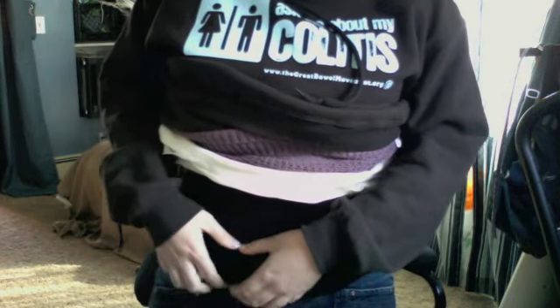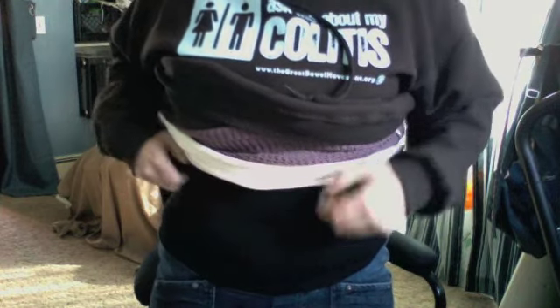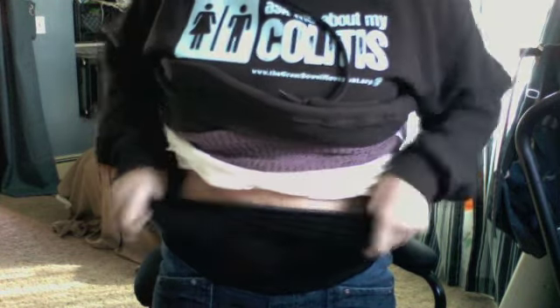Voila! First of all, you can't see it at all. It's fully supported because of the maternity jeans. And I always had a problem with wearing them down. Like if I wore them this way, I'm short. This is a midi bag, by the way. This is not the full-size bag. And even here, this piece would rub on my leg. Even if I folded it up, because these bags are awesome and you can fold them up this way, it still rubbed on my leg and was really painful.